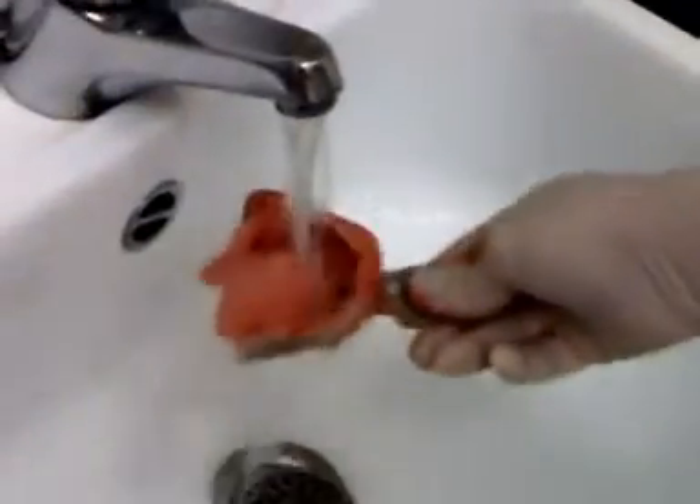We're going to rinse it out and later on it will be disinfected, ready to go to the lab with the articulator.